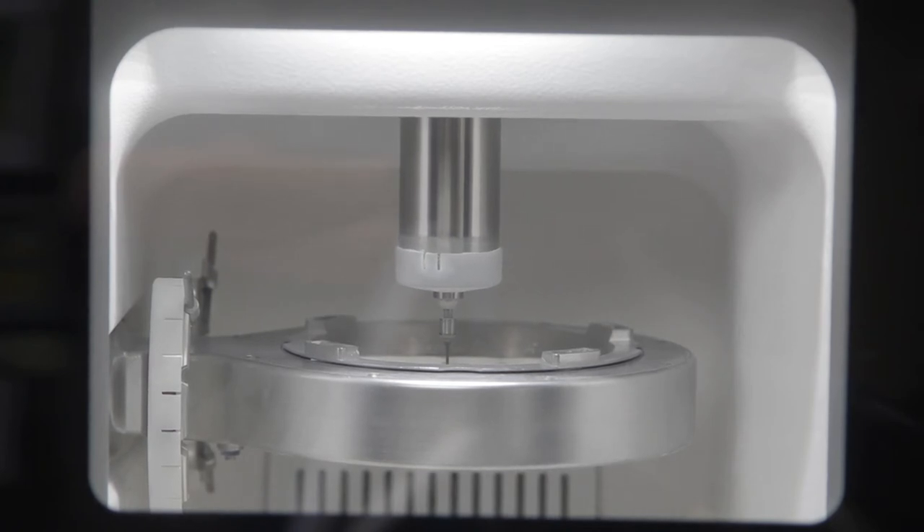Then when you go to put the crown in, it's literally: put it in, try it in, check the bite, look at it, let's glue it — it's that quick. And that's because we have dialed it down to the hundredth of a millimeter.